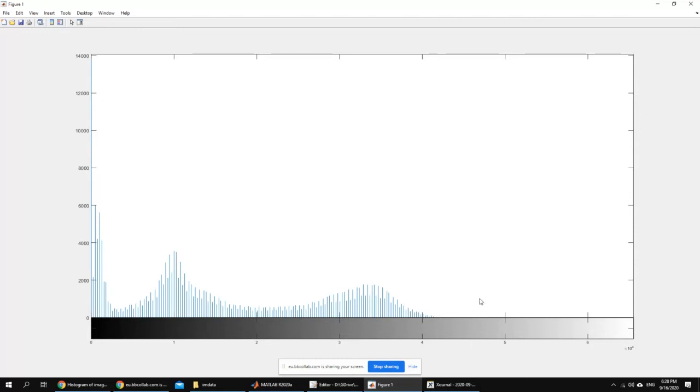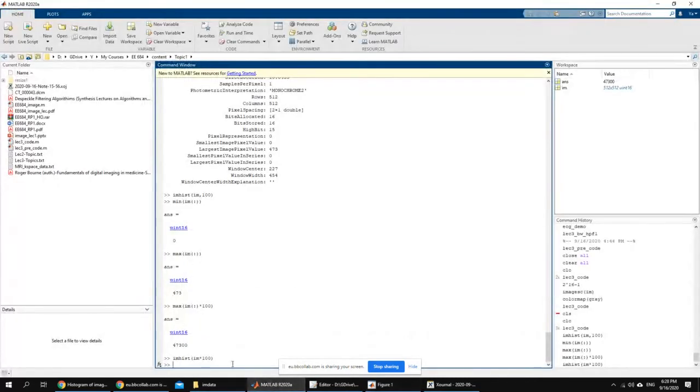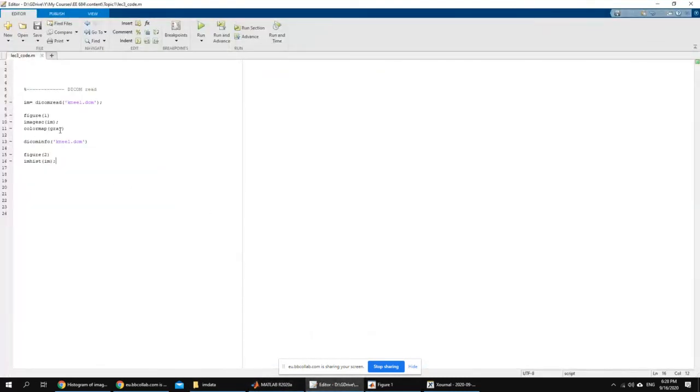If you see it like this, if you have different structures, you have the distribution, you can see where most of the pixels are, and you can adjust the image intensity based on that. One of the ways we deal with an image that looks like this, if we use imshow like what we did here, is something called contrast enhancement. Contrast enhancement takes the original image and adjusts the intensity so that it can display properly on the display.